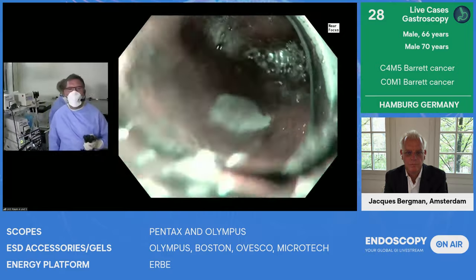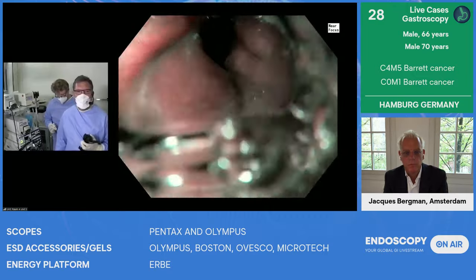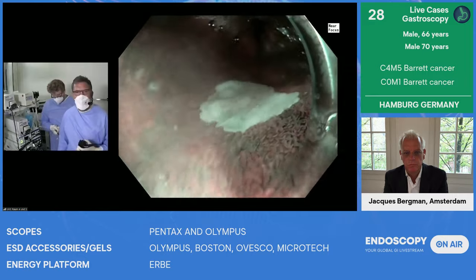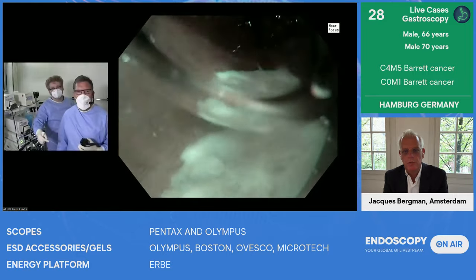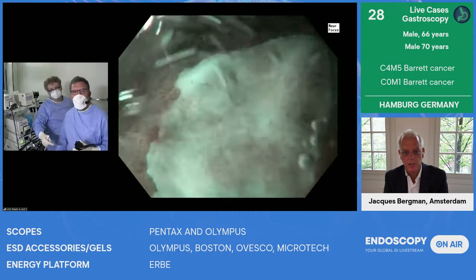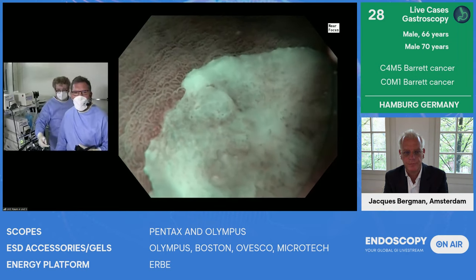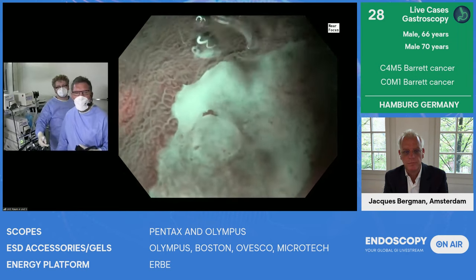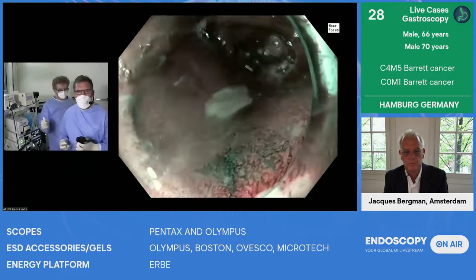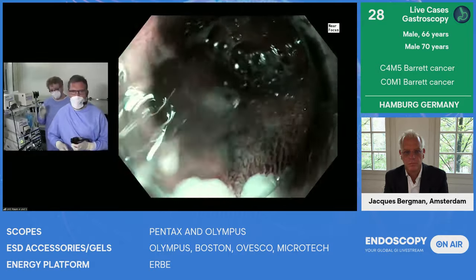What do you mean, Jacques? You are the world champion in EMR cap. So would you use a cap EMR or would you go for an ESD as well here? No, I think I would set up the resection as an ESD, anticipating that this is probably scarred. It looks scarred, and this is very fibrotic. So although it's small, and now I use acetic acid to see where the borders are.